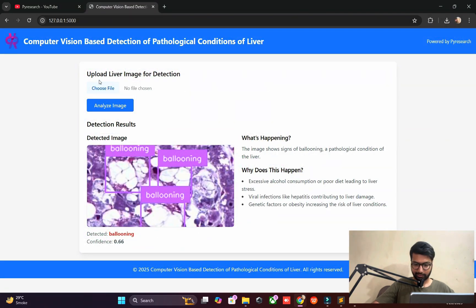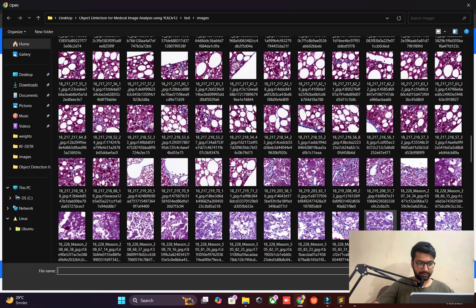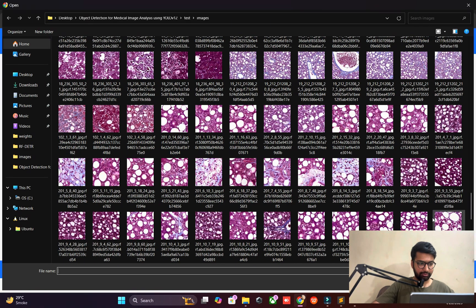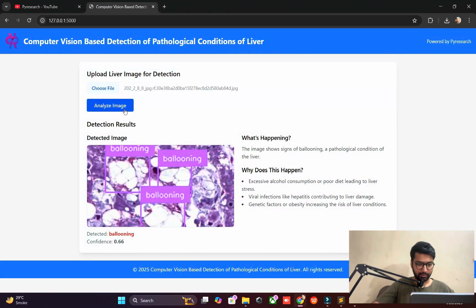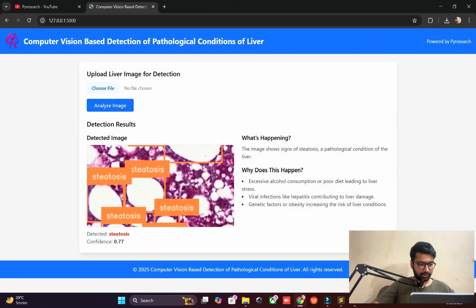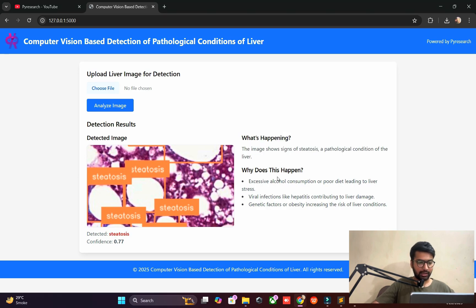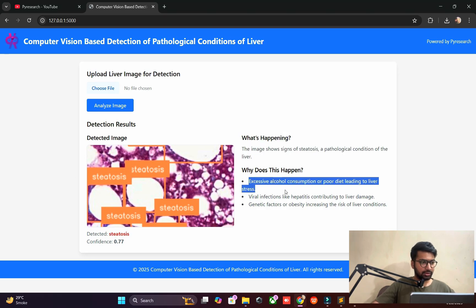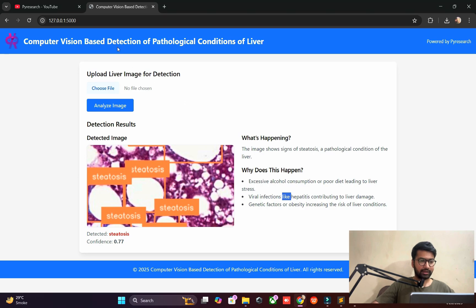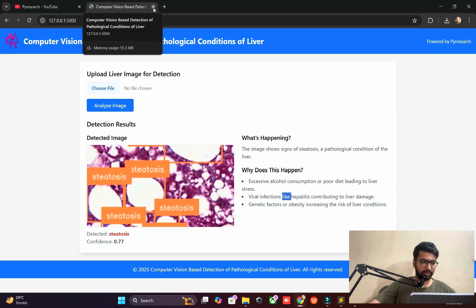I am randomly testing in front of you — here 70 percent accuracy is shown, and this one is detected. Let's look at what happened and why this happens. Let's start from scratch.